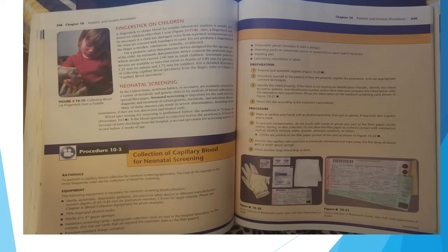Collection of capillary blood for neonatal screening. Rationale: to perform a capillary blood collection for newborn screening specimens. The heel of the neonate is the most frequently used site for collection of blood for screening. The following equipment is necessary for newborn screening blood collection: sterile, automatic, disposable pediatric skin puncture safety devices in different manufacturer incision depths. Please see Chapter 6.